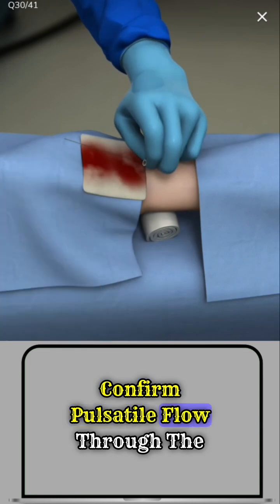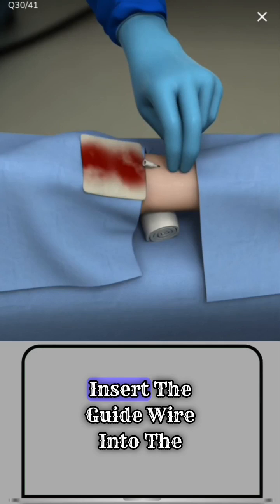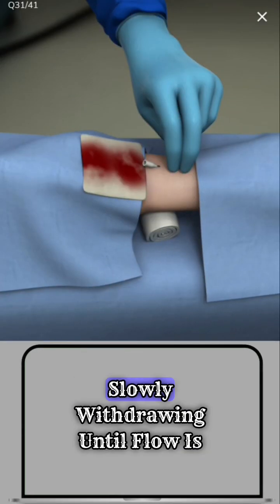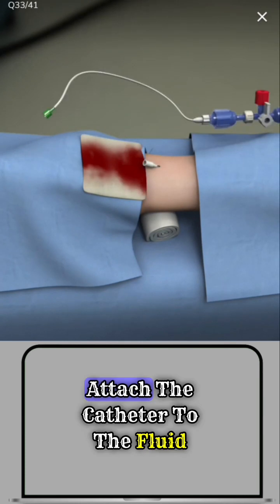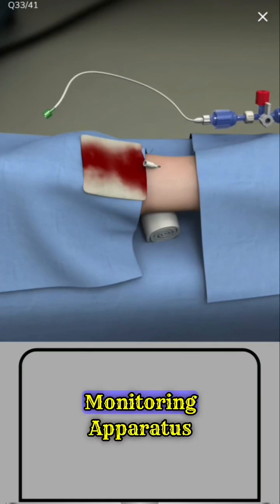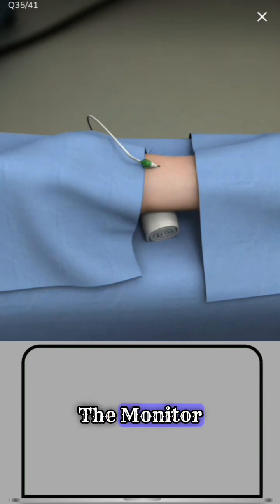Confirm pulsatile flow through the catheter. If there is no flow, insert the guide wire into the catheter and reposition the catheter by slowly withdrawing until flow is seen. Swipe to select the transducer system. Attach the catheter to the fluid-filled tubing of the transducer monitoring apparatus. Confirm a good arterial waveform on the monitor.